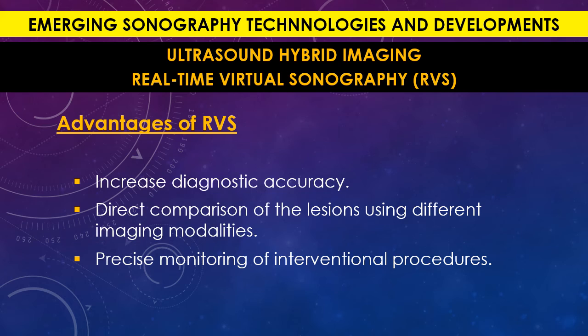So why is this complicated technique used, or why are they thinking of it? What are the advantages of this complicated technique of real-time virtual sonography or ultrasound hybrid imaging? Okay, it increases the diagnostic accuracy because two imaging modalities are showing the same spot, the same area, and you can see it. You have a comparison between the two techniques.